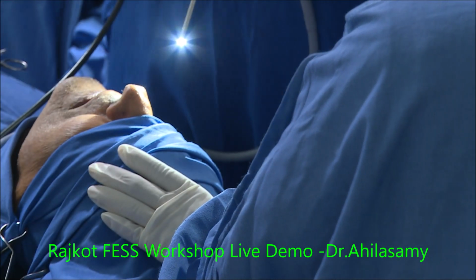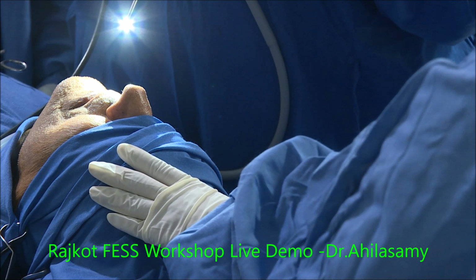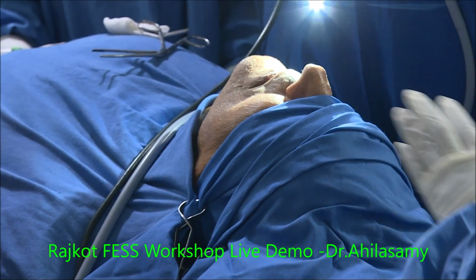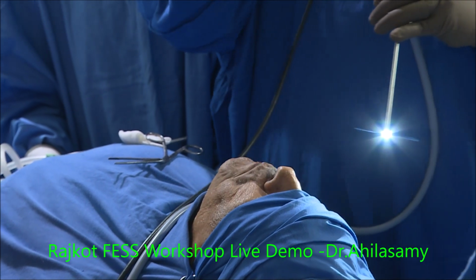So let's see. Mostly I will avoid the septal correction, because the sphenoid is quite down and there is no spur, and the high deviation will not cause any trouble for me. So, the external picture.